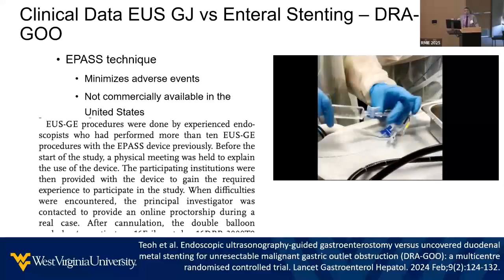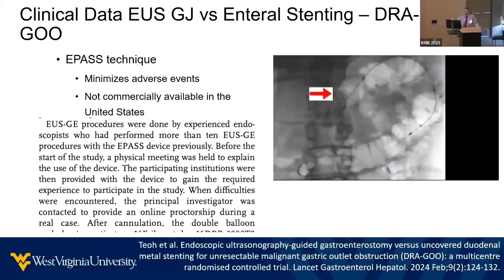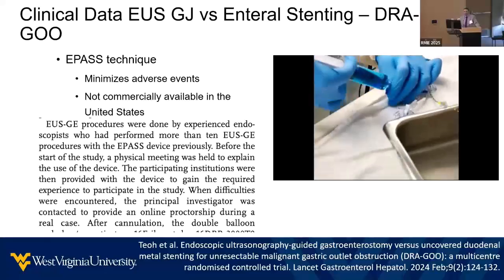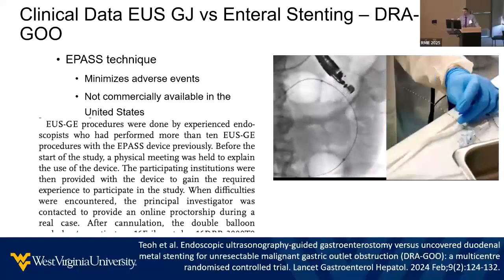All right, we would all love to have him over our shoulder with his device in performing EUS-GJ, but we can't. And as such, I think you got to take this study with a grain of salt. While it did show some clear benefit of EUS-GJ, it's a procedure for tomorrow. We're not there yet in our country today. And so, just clicking forward.